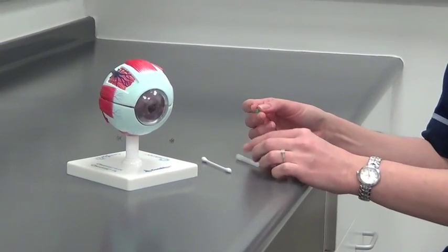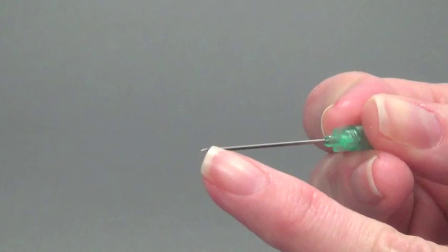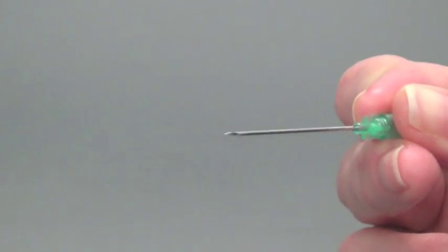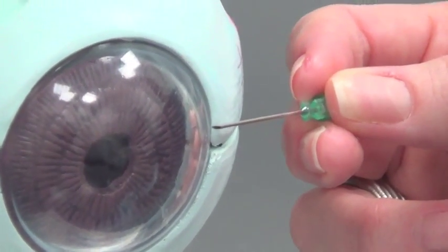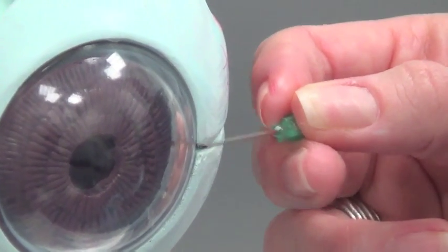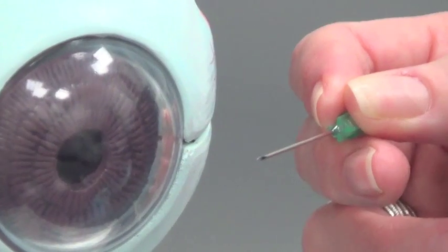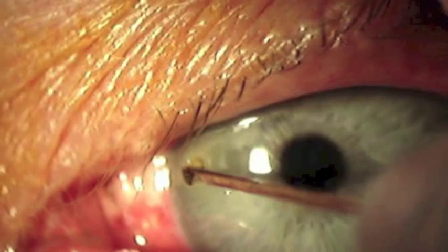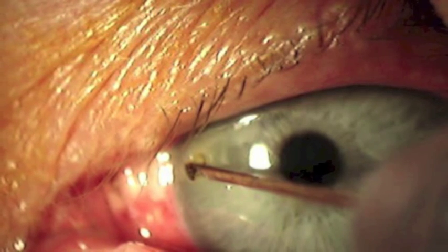You can also use a needle to perform this technique. Hold the needle in the exact same direction as the cotton bud, but with the bevelled open section of the needle facing out and away from the patient. Bring it in the same horizontal direction towards your foreign body and with a gentle swipe lift the foreign body off the face of the cornea. Here is an image of foreign body removal using this technique.